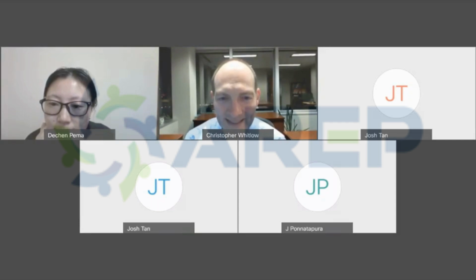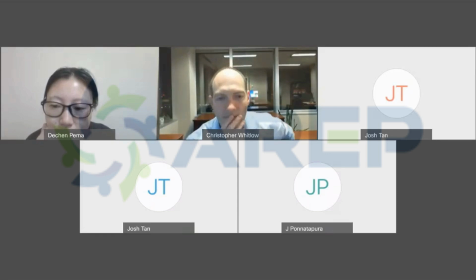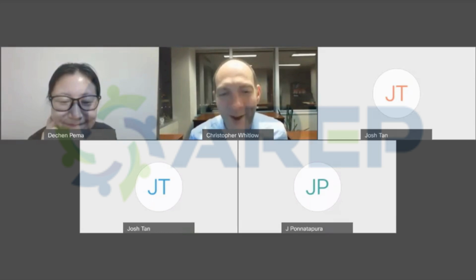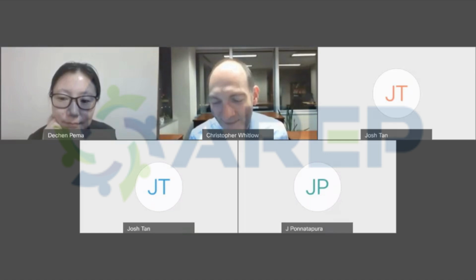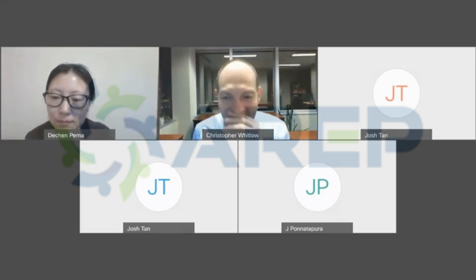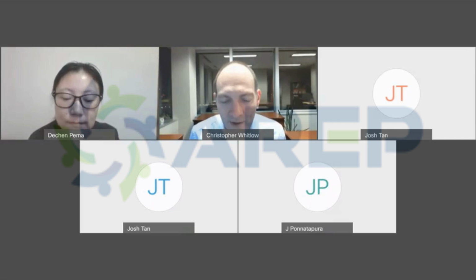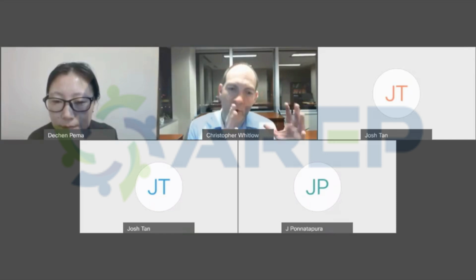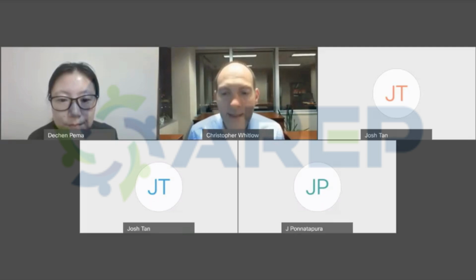I just wanted to know, is there any artificial intelligence to detect TBI? I wanted to know your thoughts and experience on that. Yes, I have a whole talk on artificial intelligence for detecting traumatic brain injury that I'm happy to give another time if people are interested. But yes, there's a lot of work in this domain. A lot of the early work was really focused on detecting blood products. There are lots and lots of algorithms, and they're frankly not very difficult to develop.